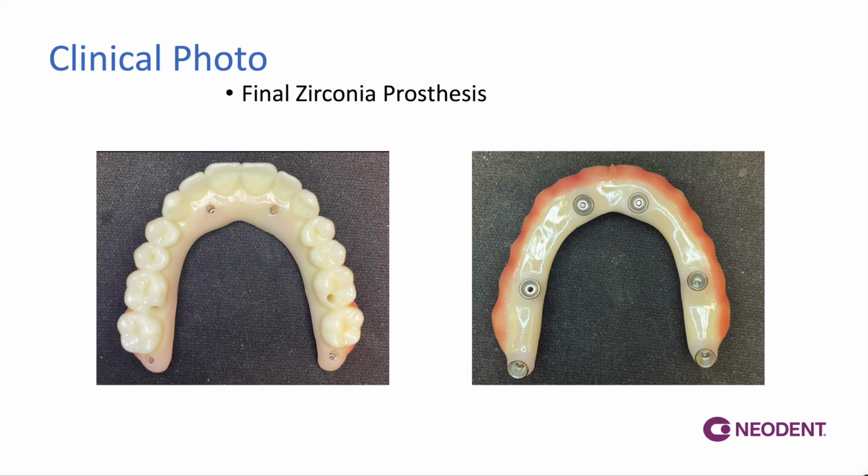However, when looking at whatever system you're using, we need to make sure that we do not have any areas of concavity. We want to make sure that the intaglio is highly polished. This is highly polished zirconia. We will not have plaque or debris adhering to this.